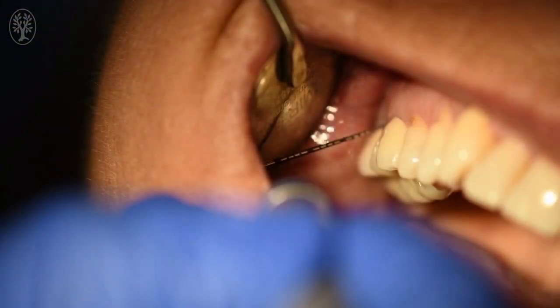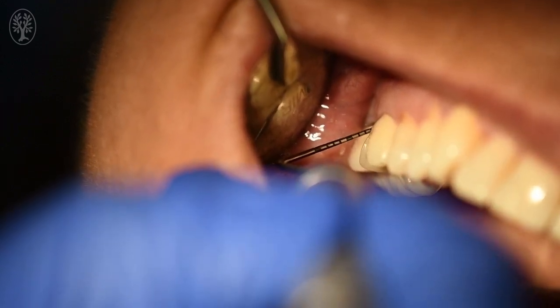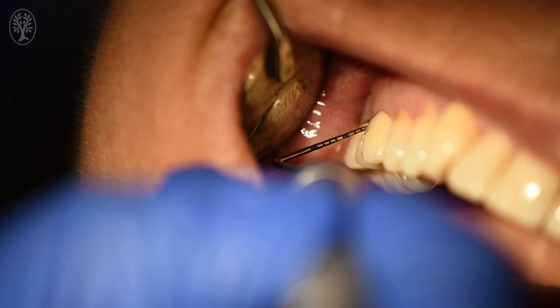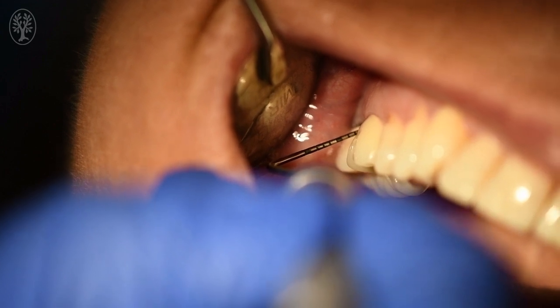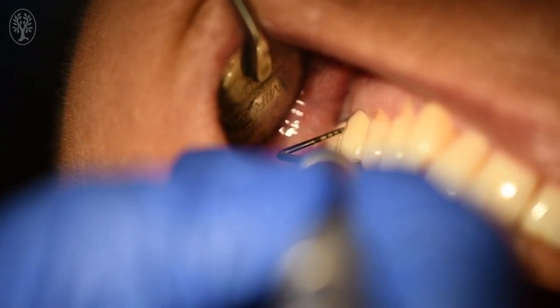Here is a case where we want to measure clinical attachment level at a deep interproximal pocket where the cement-enamel junction is not visible. So we feel for the cement-enamel junction first and use the side of the tooth as a landmark. The probe now is at 6 mm. We insert the probe now full into the pocket and the probe now is at 10 mm. The difference in probe position is 4 mm, which means the pocket floor is 4 mm apical to the cement-enamel junction. Therefore, the clinical attachment level is 4 mm at this site, and there has been 4 mm attachment loss at this site over the patient's lifetime.